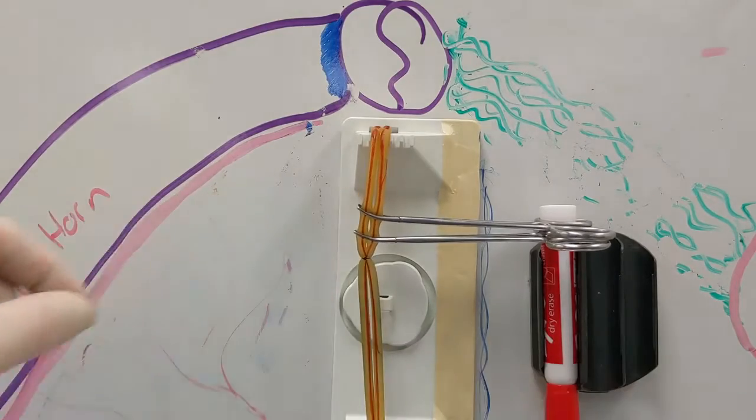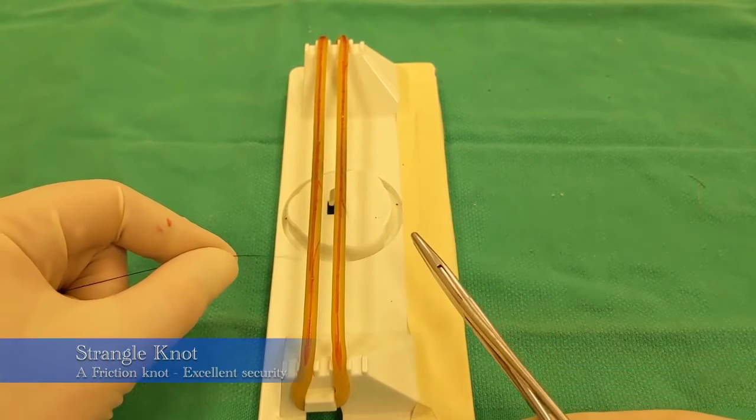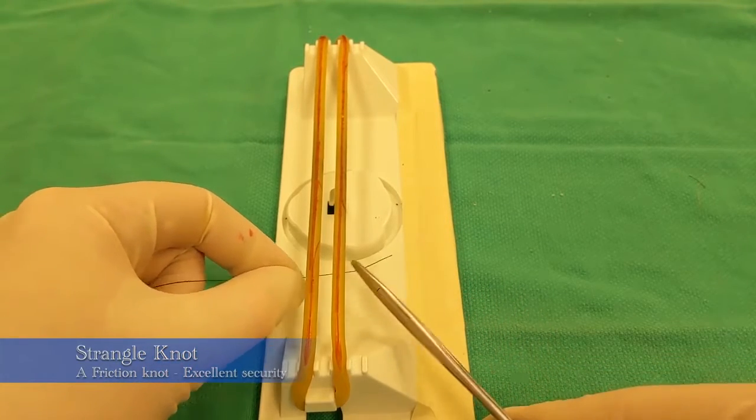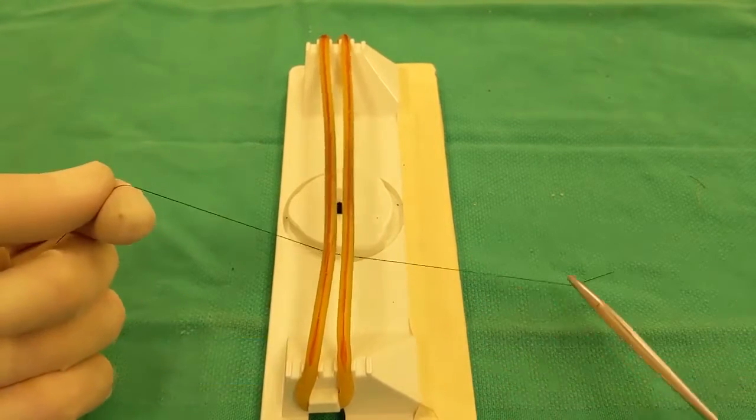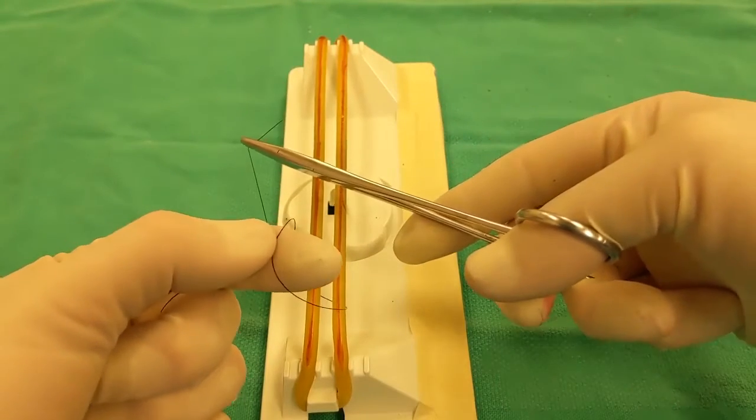Now we'll teach the strangle knot. The strangle knot also has two wraps around the pedicle. In this example, it's wrapped around from the back side and over, and that suture strand is crossed on the finger to make an X. This X should be maintained for the knot.